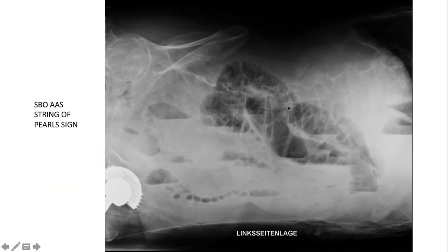Now this is not marked properly because there should be an arrow coming downward saying this part down. But you can really tell from the anatomic orientation of the organs. You can see the fluid coming down, precipitating towards the gravity, and you can see air going upwards. So this is also an indication of bowel obstruction. This is small bowel obstruction. Alright, so this answers our question of the previous radiograph that we said we'll go back to later. It was actually a small bowel obstruction.